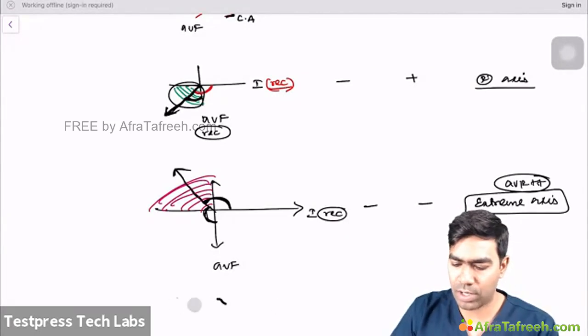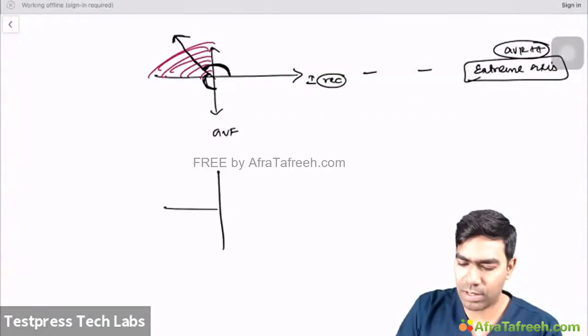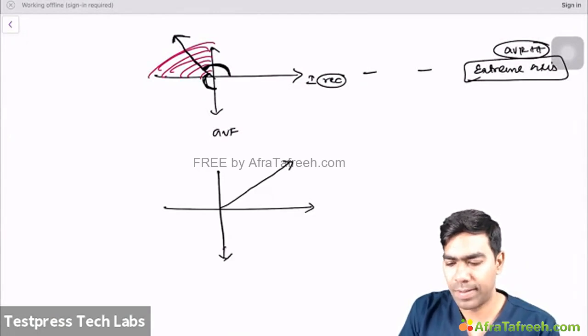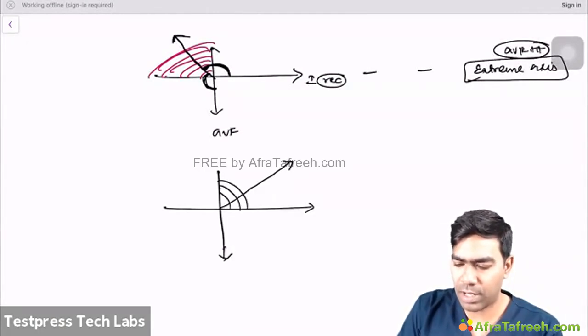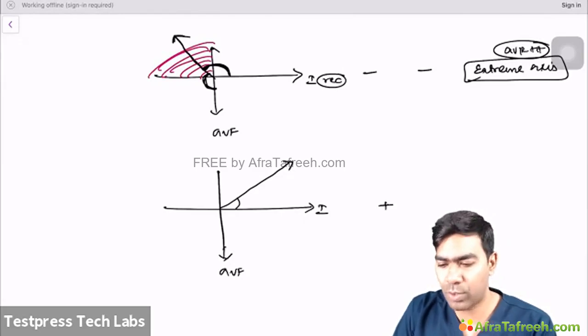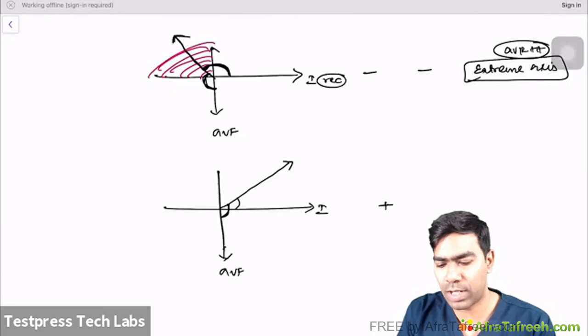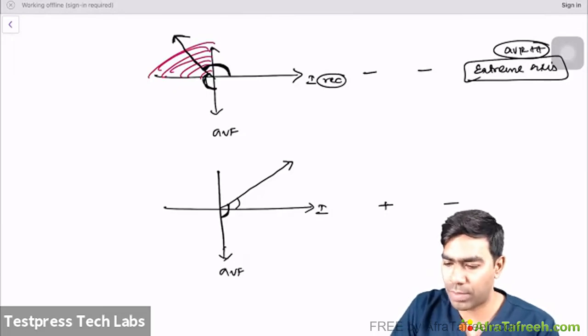Final, last but not the least, this is a tough thing to understand, because if you have the axis in this particular quadrant, the angle between 1 and the cardiac vector will usually be less than 90, so it must be positive. But the angle between AVF and the cardiac axis is definitely more than 90 degrees because it's crossing one full quadrant, so it must be negative.